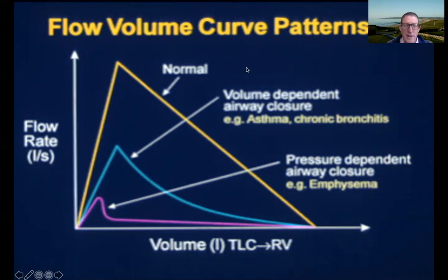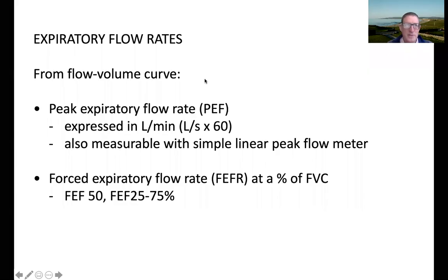So those are the main patterns. The reason I'm showing you this is to show you where the peak expiratory flow rate comes from. So that's the peak flow that you can breathe out in the first second, which is usually expressed in liters per minute. So that would be liters per second times 60.